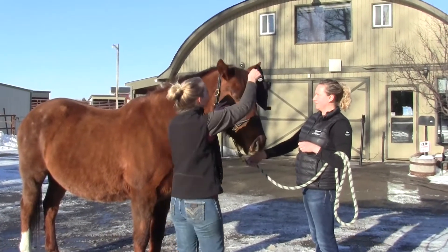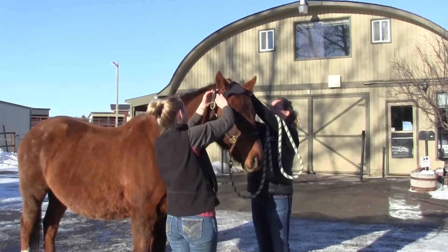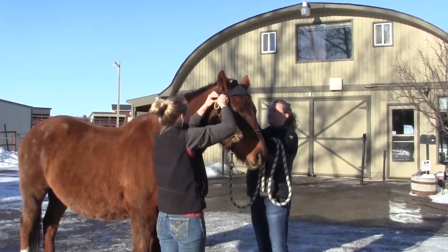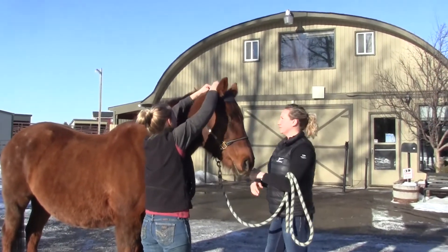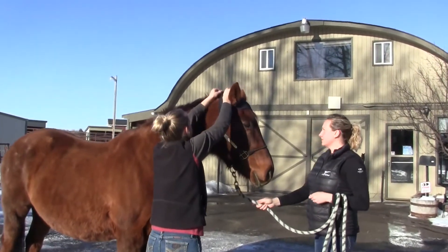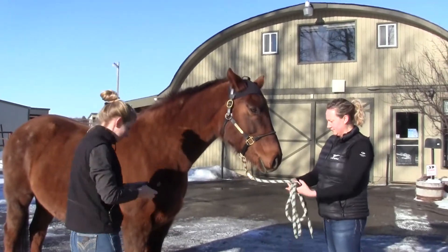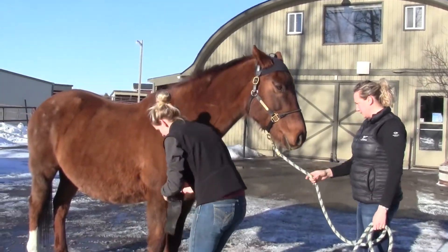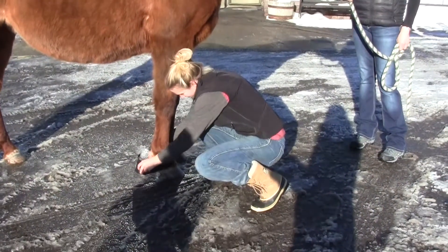In this video I'm going to talk about the Lameness Locator and the ways we can use it in a lameness exam. It consists of three wireless sensors: one goes on the horse's head, one on the horse's right front foot, and one on the horse's pelvis. The one on the right front foot measures which foot is on the ground at what time, while the ones on the head and pelvis measure the horse's torso movement up and down with each stride.